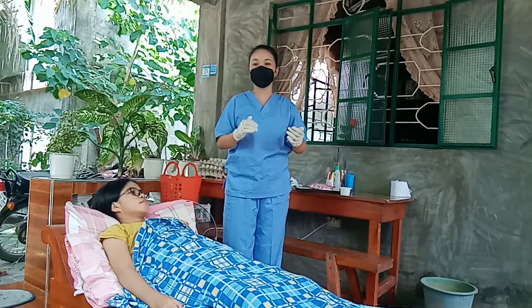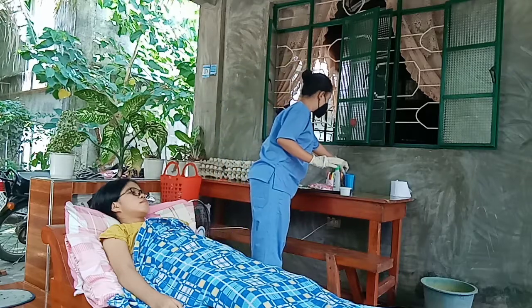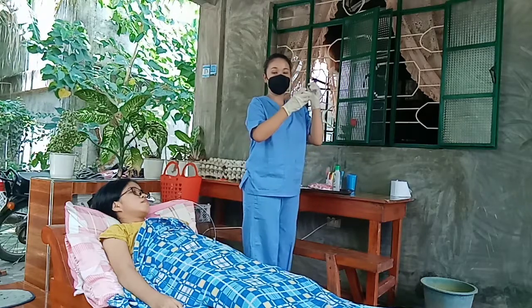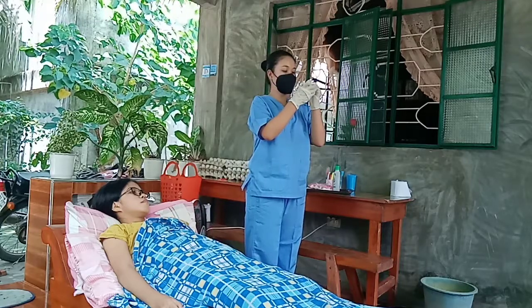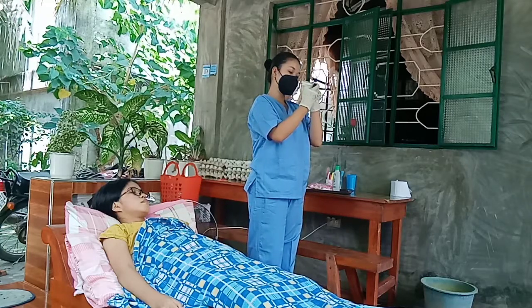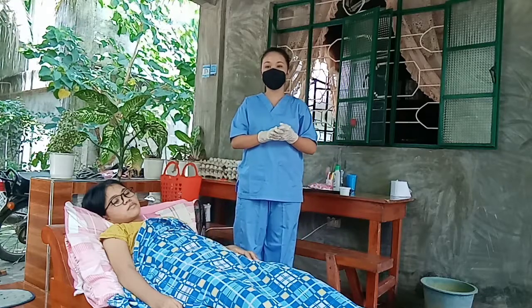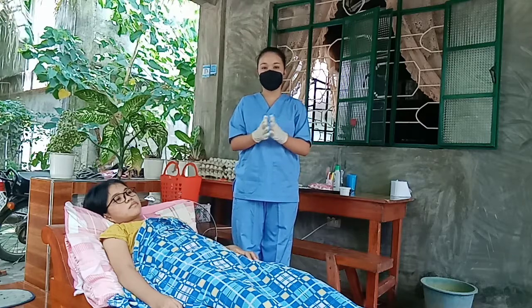Then next is secure label to container, then complete label properly. Make sure that you label the container itself, not the lid. Then next is dispose the soiled supplies, then remove and discard gloves, then perform hand hygiene.